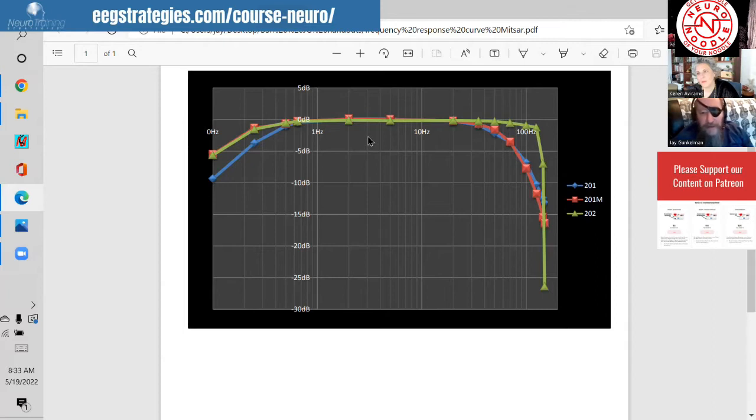So you're not loading down the signal that you're measuring, so you can measure it accurately. The normal baseline drift in an EEG is somewhat eliminated. If there's movement, it's not eliminated, but just baseline drift of the electrode itself, which is present in regular electrodes with polarization potentials, it's just not present in silver chloride electrodes.